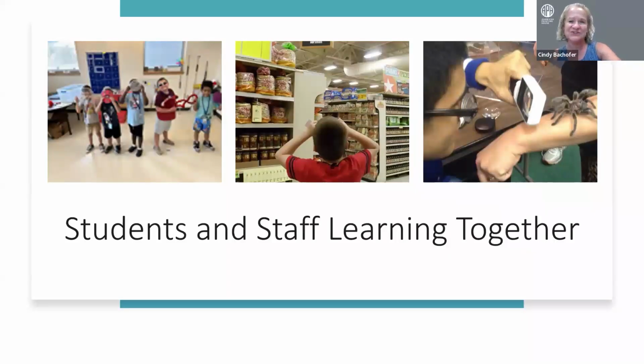So again, getting students together, learning about eye anatomy, taking a device into the community setting like a grocery store. The student in the picture there is examining a tarantula. That is not my arm. I can identify that is not my arm that the tarantula is sitting on. But what's the hook to get students interested in that? If I can make this target bigger and see the detail, then I'm interested in using that tool.